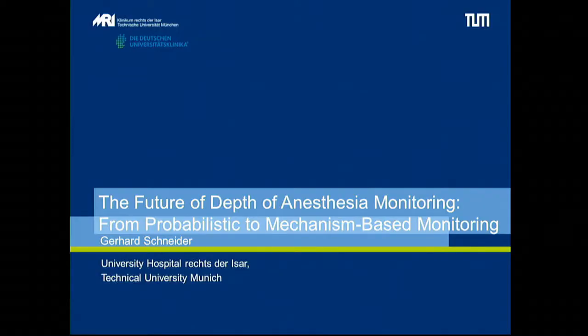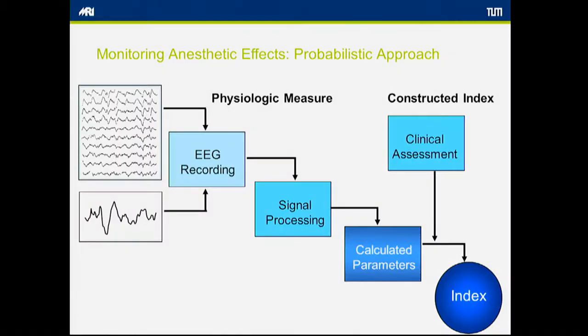And it's a pleasure to talk to you about the depth of anesthesia monitoring, possible future in this field from probabilistic to mechanism-based monitoring. I'm sure all of you are aware of current concepts of depth of anesthesia or hypnotic level of anesthesia monitoring.